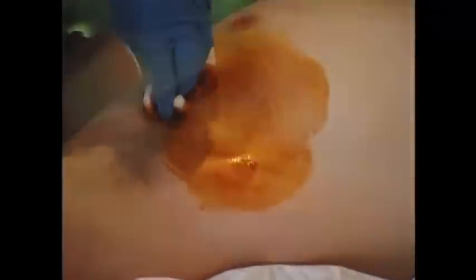With the patient lying supine, position the hand up and over the ipsilateral shoulder and secure it in this position to keep it out of the surgical field. Surgically prep and drape the chest at the predetermined site of tube insertion.